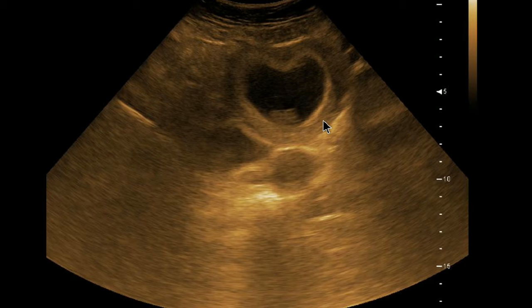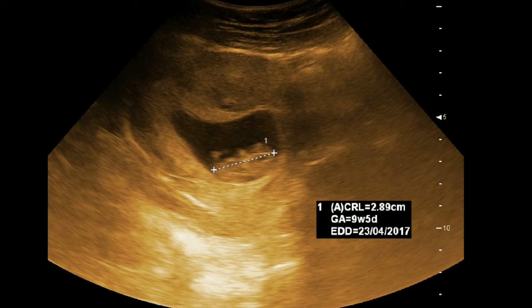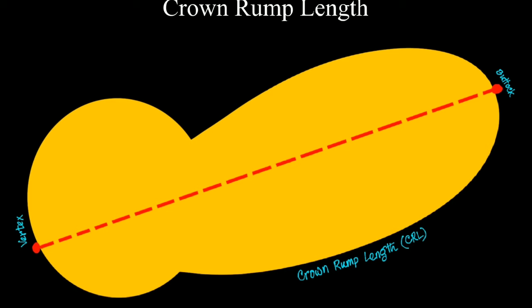After 7 or 8 weeks, the gestational sac doesn't remain round or oval. Here you can see a heart-shaped sac. The sac is not suitable for gestational sac diameter or mean sac diameter measurement. Fortunately, by this age we have the CRL. We want to go for measuring the CRL with crown-rump length, which is the most accurate parameter throughout the gestation.